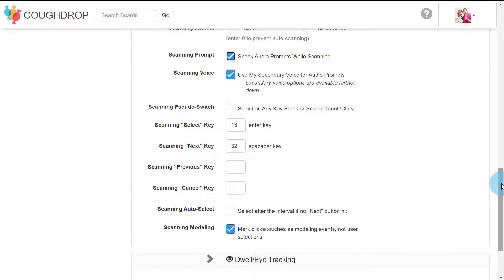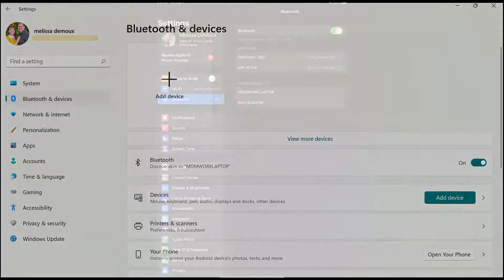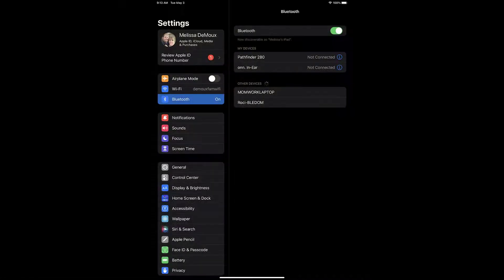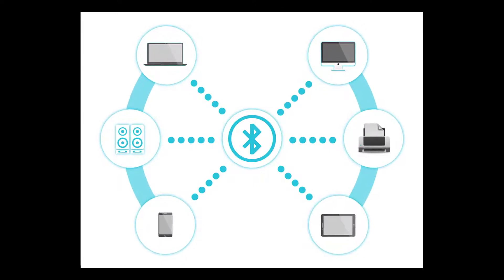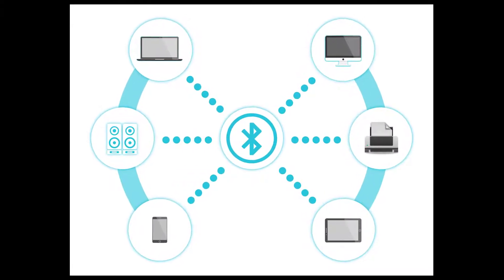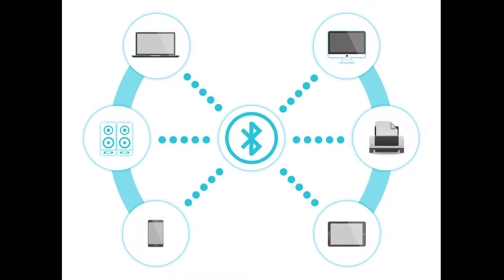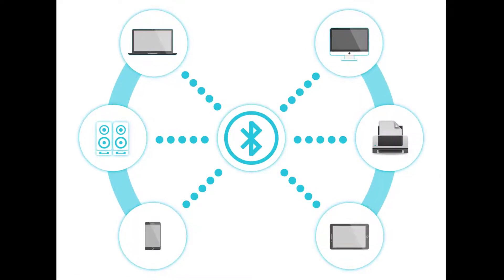To use a Bluetooth switch or Bluetooth keyboard, you will need to pair those with your device before beginning this process. This can be done on the settings page of your device. CoughDrop integrations are designed to work with Bluetooth switch options. While you are welcome to connect a corded switch to your device, the scanning features may or may not respond well to corded switches. We strongly recommend use of a Bluetooth switch.